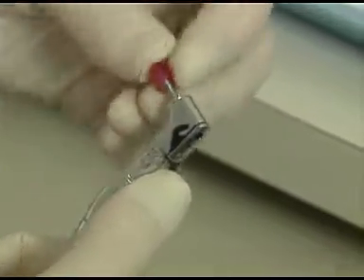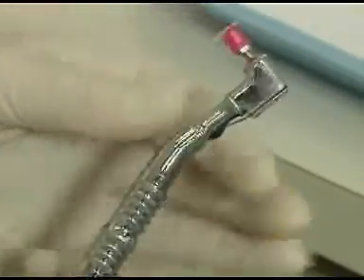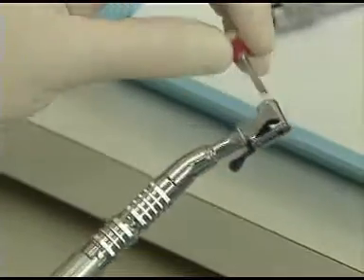Now make sure that they are always locked securely in position. To remove, unlatch the rotary instrument and then slide off the straight handpiece.